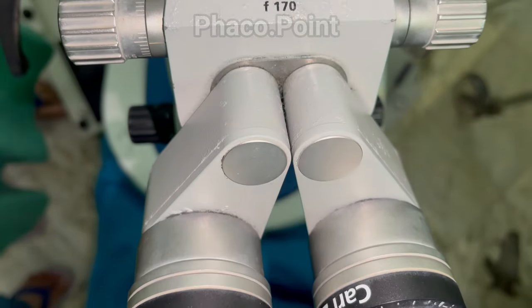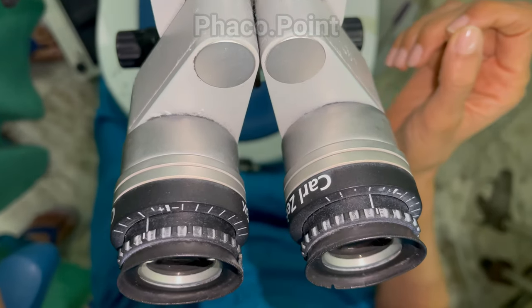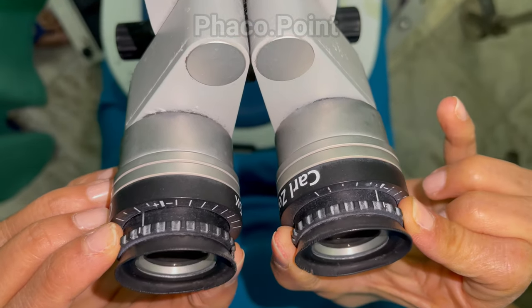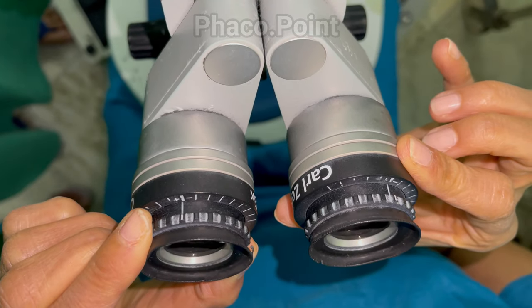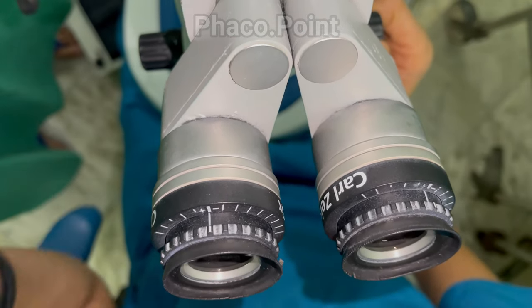It is important that the surgeon adjust the microscope for optimal visualization during the cataract procedure. The first thing the surgeon needs to do is adjust the zero on the oculars on both the right and the left side, as demonstrated.